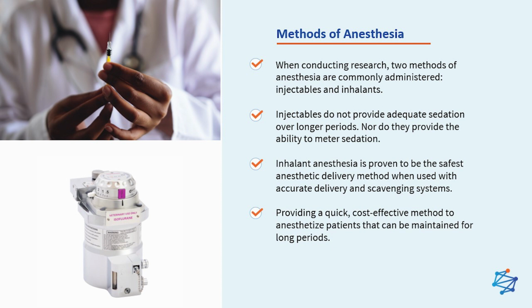Methods of anesthesia: when conducting research, two methods of anesthesia are commonly administered, injectables and inhalants. Injectables are as they sound, injected via intravenous therapy directly into the patient's vein, whereas an inhalant is administered via nose cone, mask, intubation, or breathing apparatus, and inhaled by the patient.